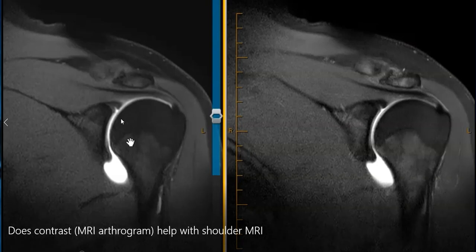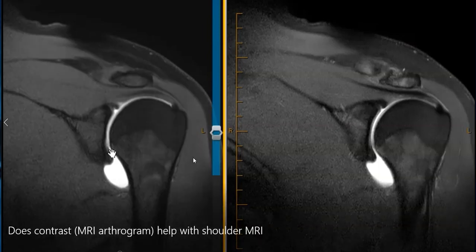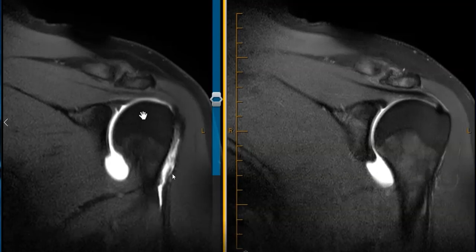Developmental defects can look just like a labral tear, except they tend to go in this direction, hugging the cartilage. Again, in this view we see a similar little bit of bright signal, just not showing up as well. In this view the labrum looks a little bit more irregular. In this view you can still see that cartilage — it does look like it hugs the cartilage. This is a case where we see something better because we have that contrast distending the shoulder joint. Without the contrast it looks very similar, but it adds a little bit of detail if your doctor is really worried about a labral abnormality.